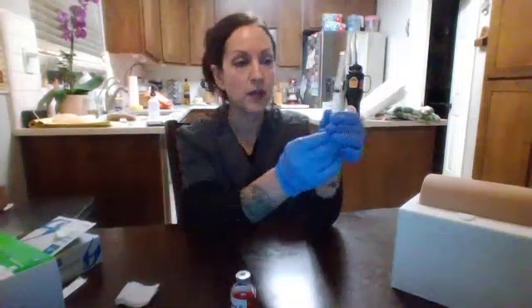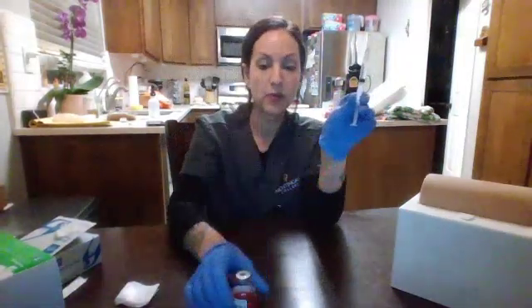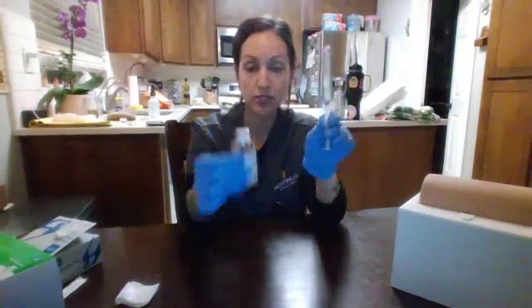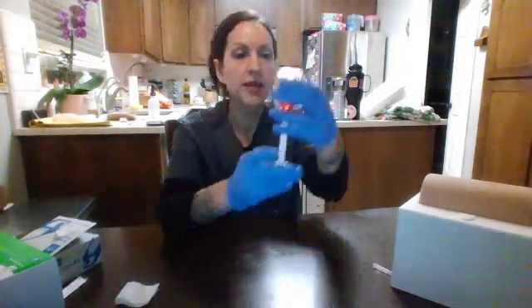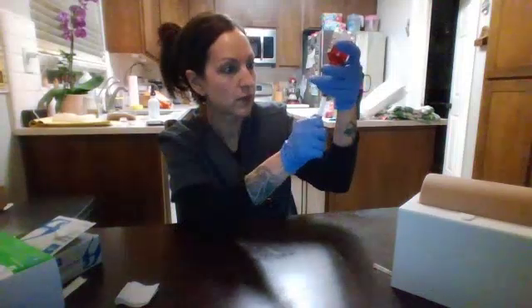With the cap still on, I'm going to go ahead and pull down the plunger to 1.5 mLs, which would be equivalent to the 1.5 mLs of medication that I'm going to be administering to the patient. I'm going to carefully remove the cap, insert the needle into the vial, inject the air, invert, and pull down to 1.5.